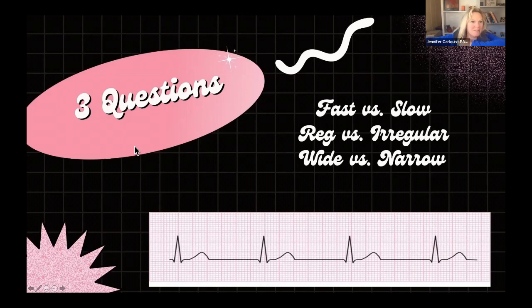Good, Karen, and Facebook, yes. So we have some votes for junctional and we have some votes for idioventricular. I will tell you that this one is a hard one. So Melissa says, no P wave, idioventricular.